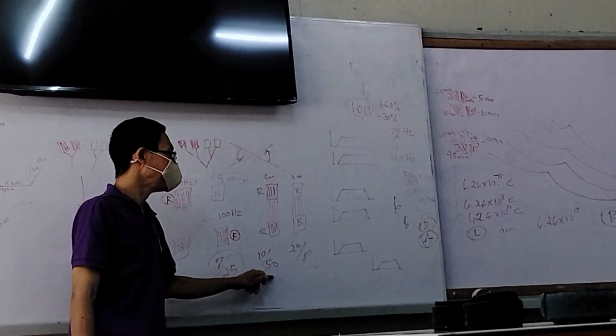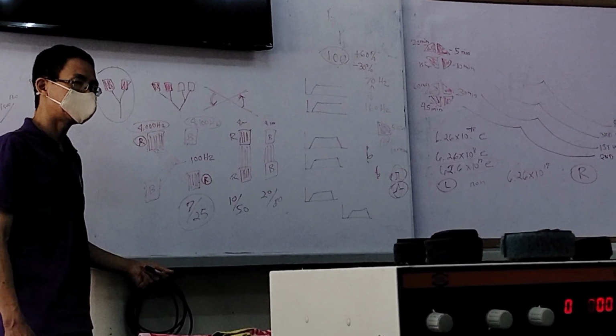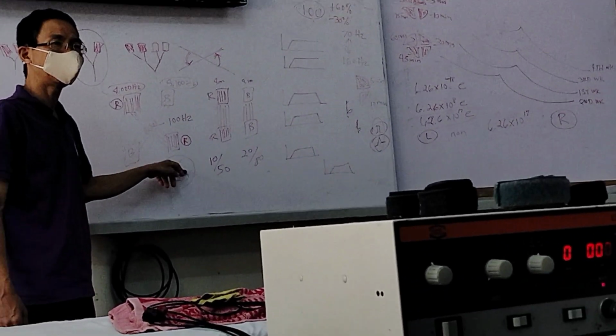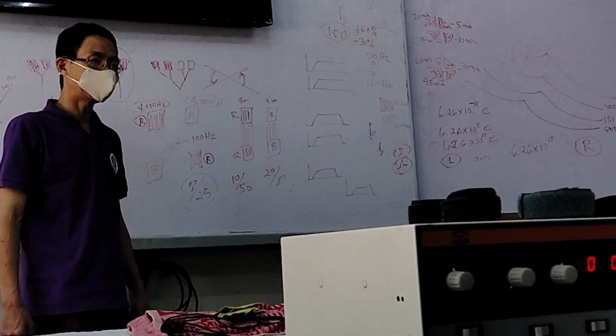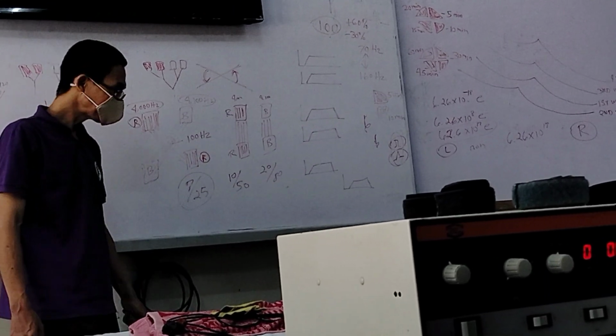Okay, the denominator indicates the relaxation of the muscle, or the time of rest without contraction. In 7/25, it is 25 seconds of rest, no contraction. In 10/50, 50 seconds without contraction. And then 20/80.